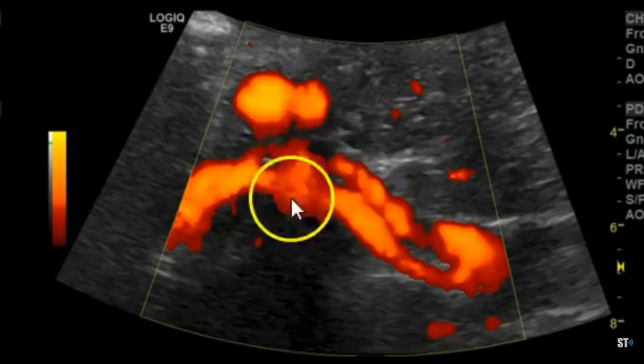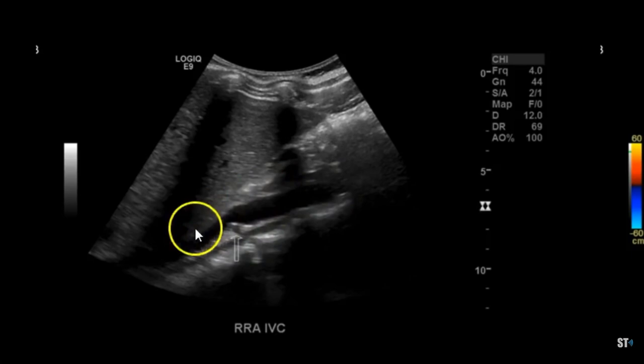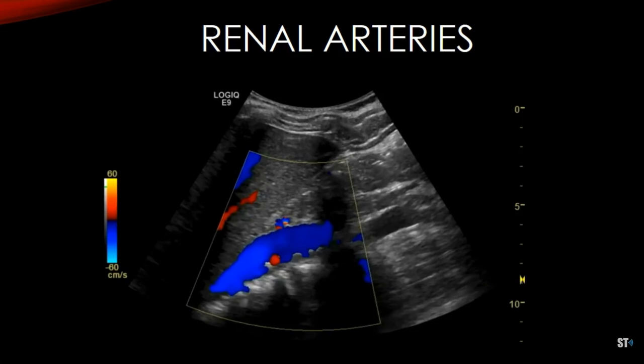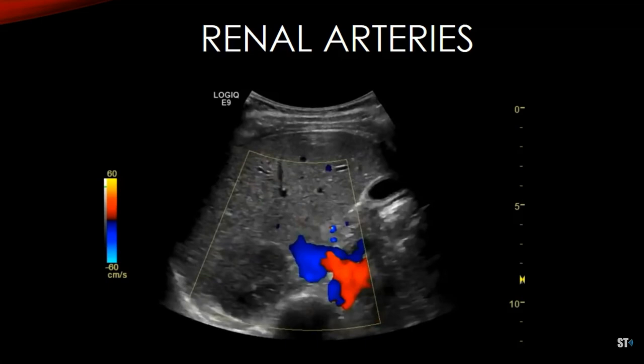Here's another view of the right renal artery posterior to the IVC — that's very important. With this view, you can even see if there are multiple renal arteries; you'll see more than one circle. And here's with Doppler. If you're having a hard time getting the anterior approach with the vessel in longitudinal, you can go to the IVC, find your right renal artery behind it, then turn 90 degrees. You will see the right renal artery in longitudinal — there's your right renal artery with the right renal vein. That's a neat trick.